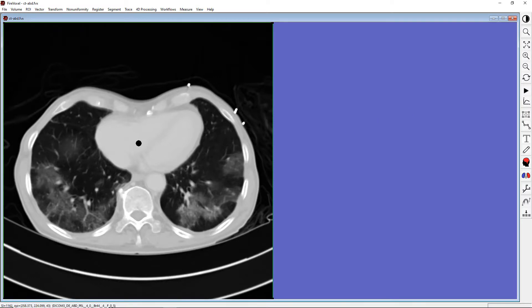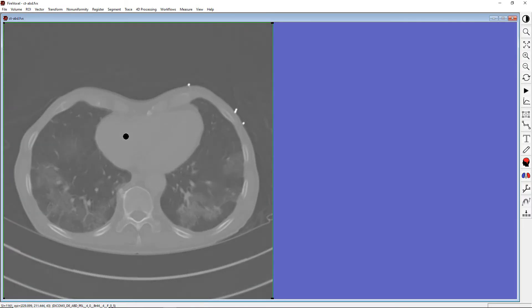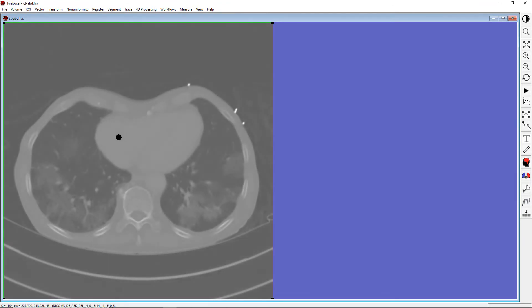To increase the window width, left-click on the image, hold down the mouse button, and drag the mouse horizontally towards the right. To decrease the width, drag the mouse towards the left.